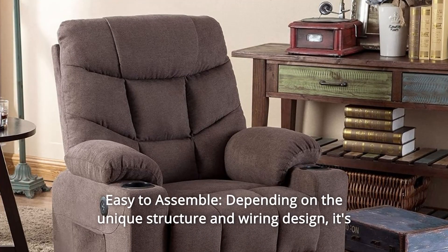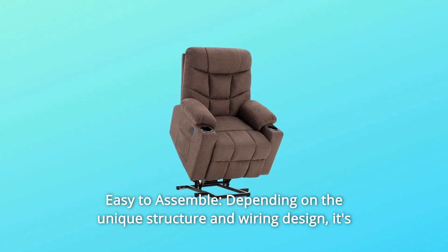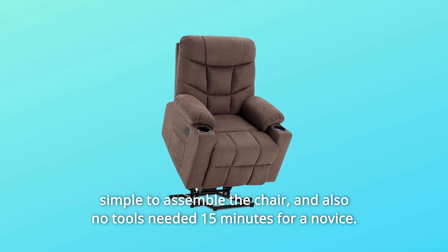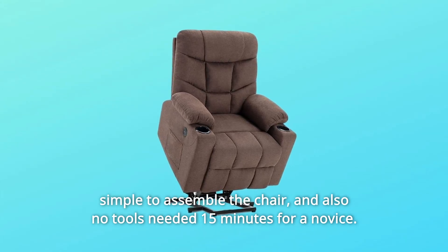Number 2: Easy to Assemble. Thanks to its unique structure and wiring design, the chair is simple to put together — no tools needed, and a novice can complete it in about 15 minutes.